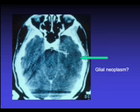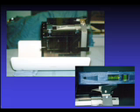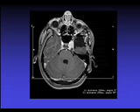In this lesion here, we have a low-density lesion in the left temporal lobe that is poorly seen on CT and perhaps better seen on MRI. If MRI is used, there needs to be a device to fixate the stereotactic frame in the fiducial box into the more circular cradle of the MR device. In a stereotactic system such as a Leksell frame, orthogonal images, both parallel and perpendicular to the frame, are used to obtain images that are usable for stereotactic coordinate determination. Other systems do not require this.